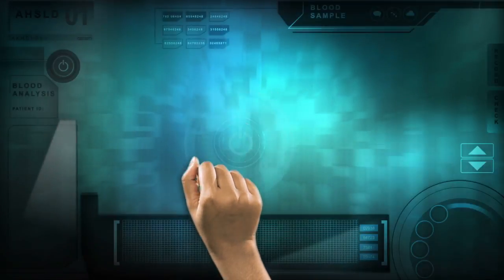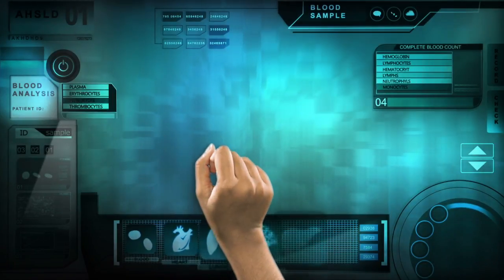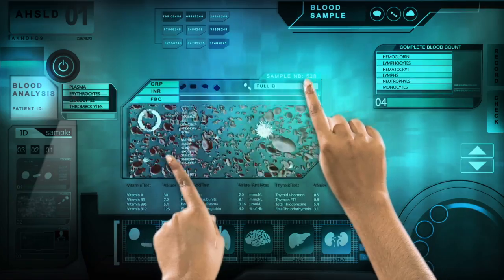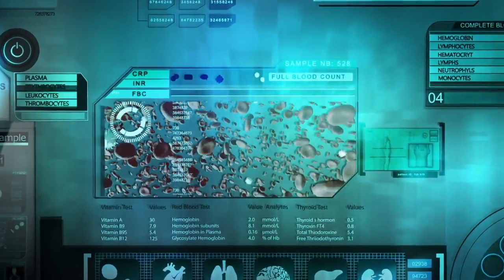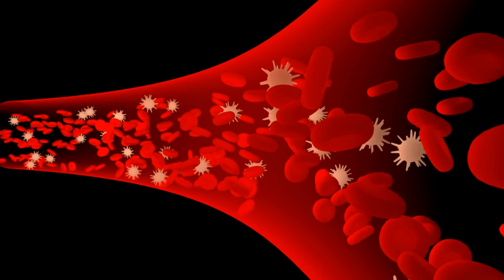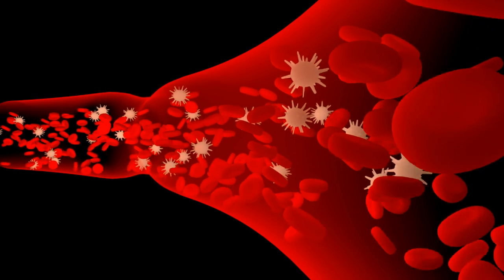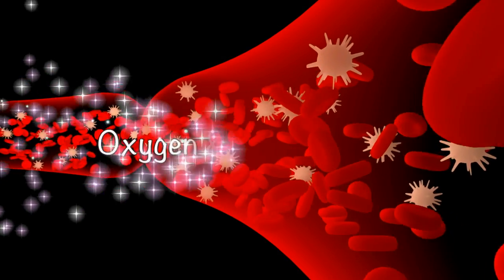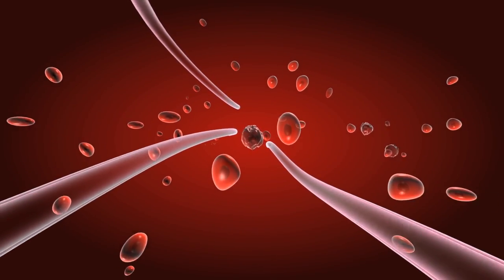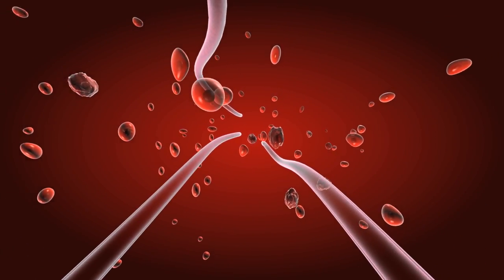However, this method is highly subjective to interpretation due to the training, or lack thereof, in the identification and analysis of red blood cells. In this module, red blood cell indices will be reviewed in correlation to red blood cell morphology. Variations in the indices indicate the probable presence of altered structure causing altered function of the red blood cells.